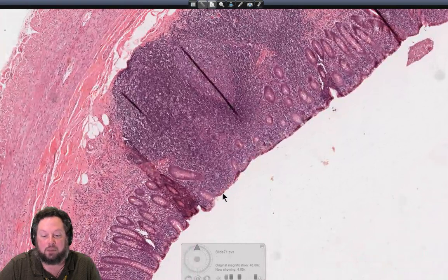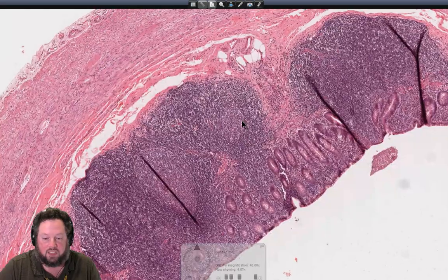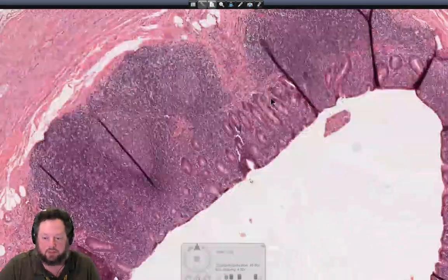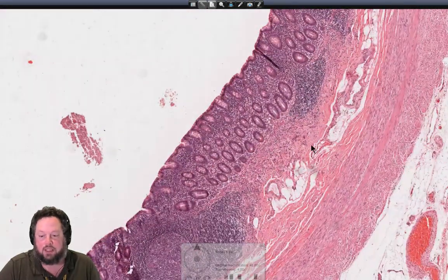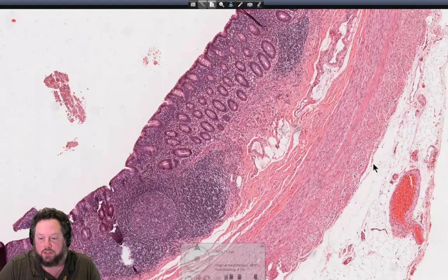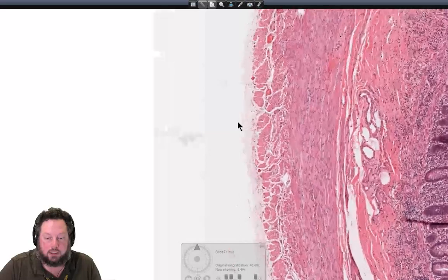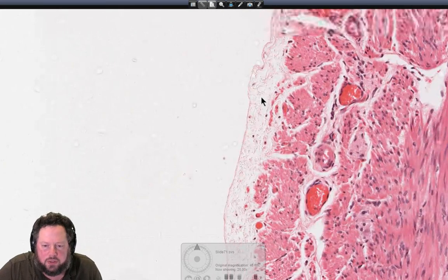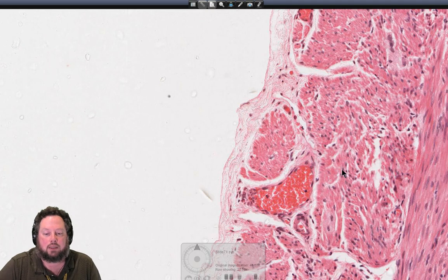Sometimes the epithelium can even be disrupted here. So we've got these big accumulations of follicles here. There's a nice germinal center here. See this sort of paler region here? It means these cells have been activated in this tissue. But again, we've got lots of goblet cells, simple straight tubular glands. I've got our muscularis, submucosa here, muscularis there, and obviously a nice serosa on the outside. A bit difficult to see the squamous cells, nuclei there, but it certainly looks like it.